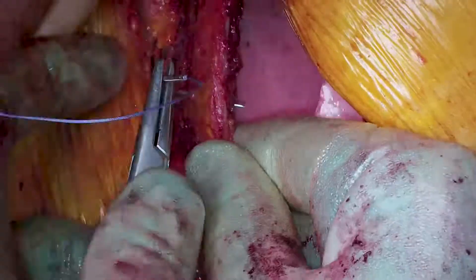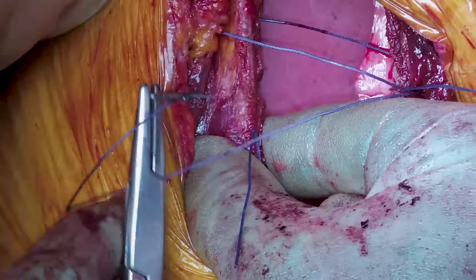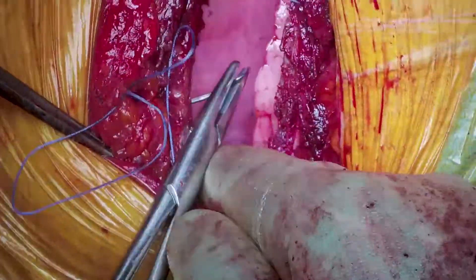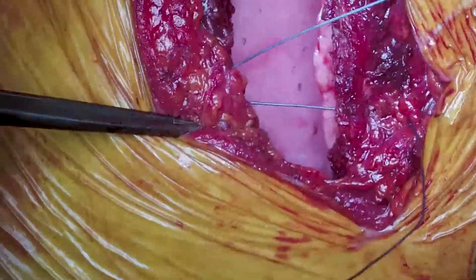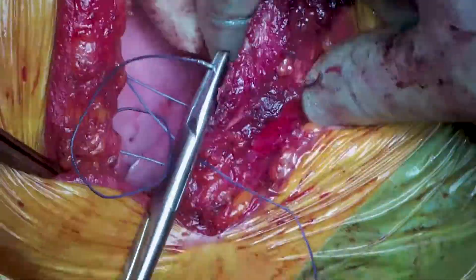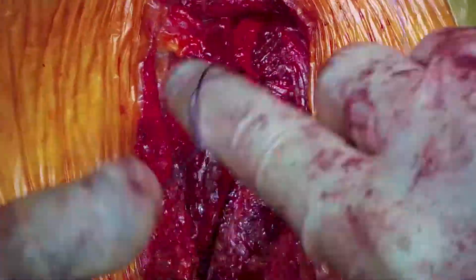The main part of the operation is done and we're closing the thoracotomy using two number two polysorb braided absorbable sutures in figure-of-eight configuration to bring the ribs closer together. Mr. Dunning tries to go as far above the nerve as possible to avoid crushing it, as this causes post-operative pain. He previously used to drill a hole in the rib to completely avoid the nerve, but the drills are no longer available. The key is not to tie the sutures too tightly — just bringing the ribs together to help them heal.